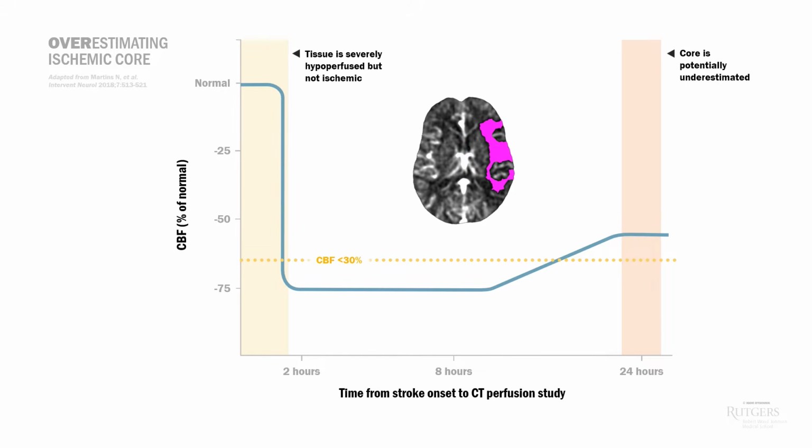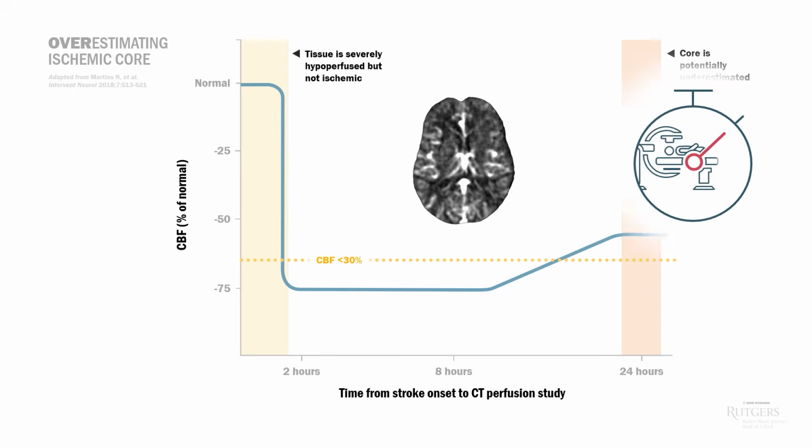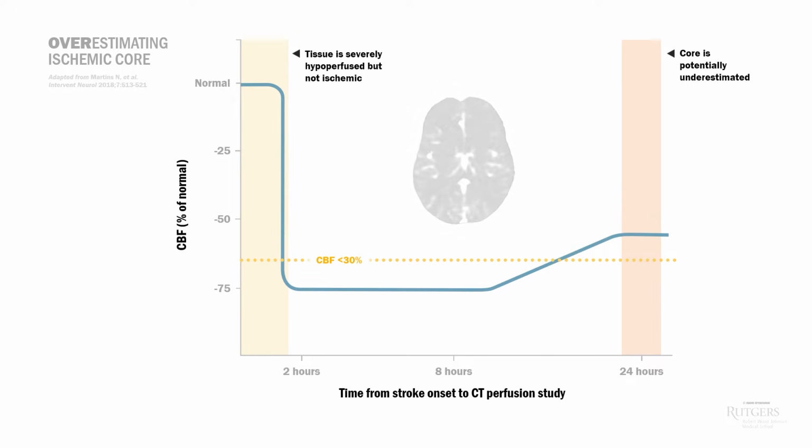If a patient presents early enough after stroke onset and reperfusion is quickly accomplished, the core seen on CTP would disappear. This is especially true of patients presenting within the golden hour. But you'll say, Dr. Ribinik, in DAWN and DEFUSE 3 trials, CTP was performed at or beyond 6 hours from last known well, so none of the patients were scanned within the golden hour, weren't they?